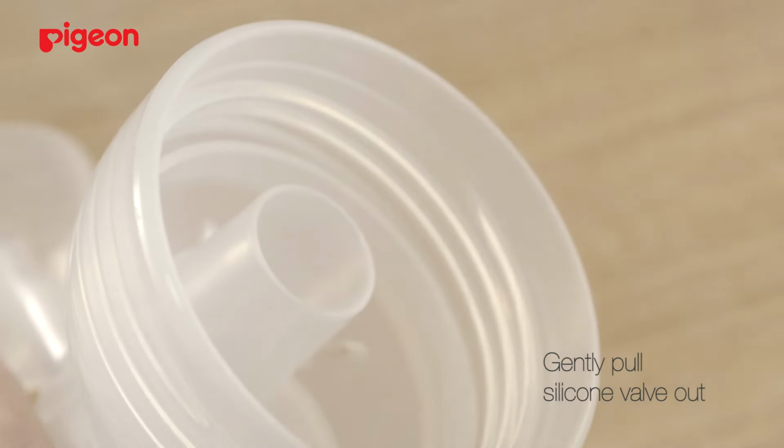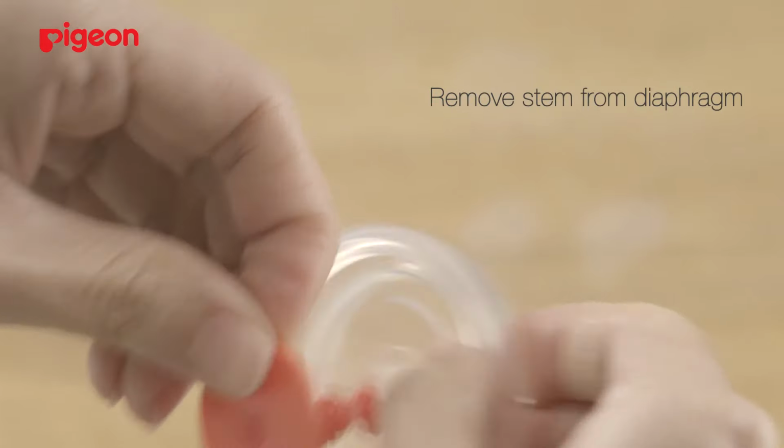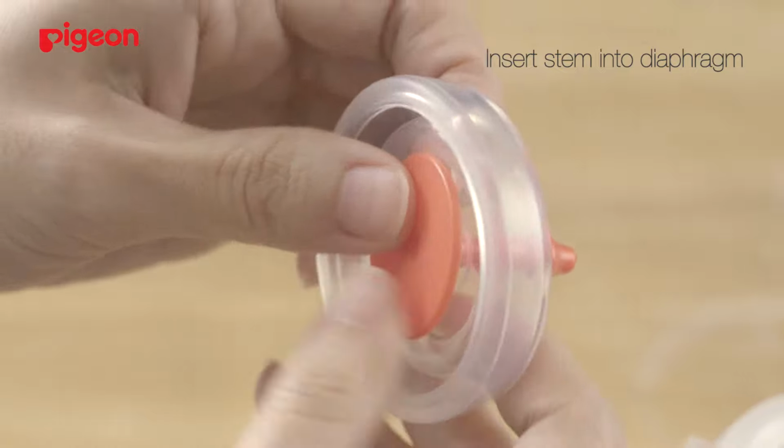Gently pull the silicone valve out. Detach the diaphragm from the main body and the stem from the diaphragm. For assembling, follow these steps. To begin, insert the stem into the diaphragm.